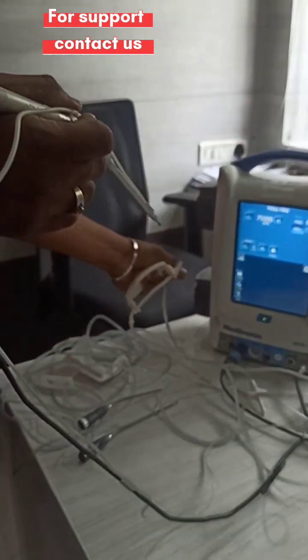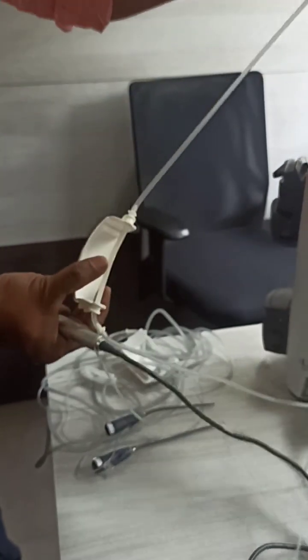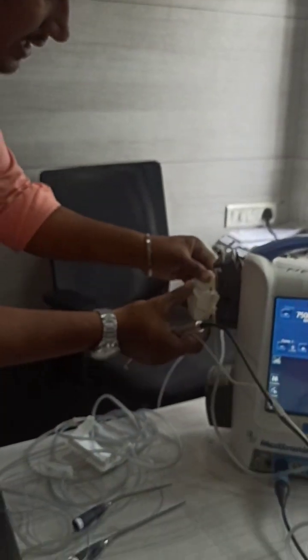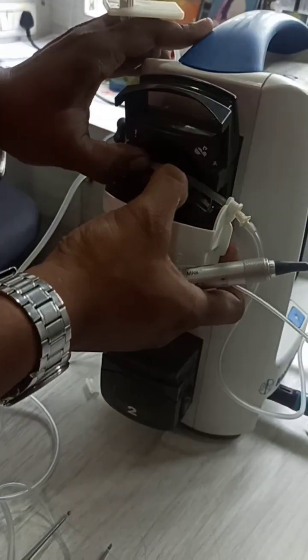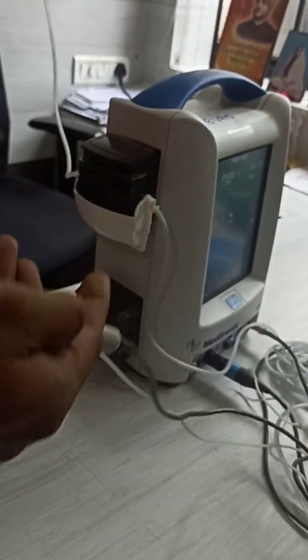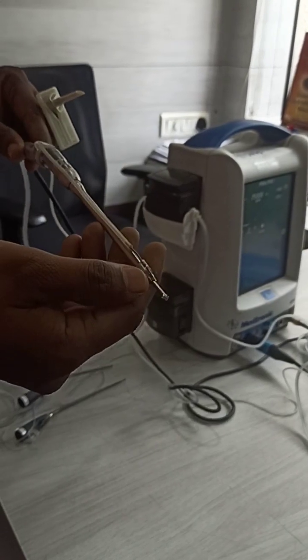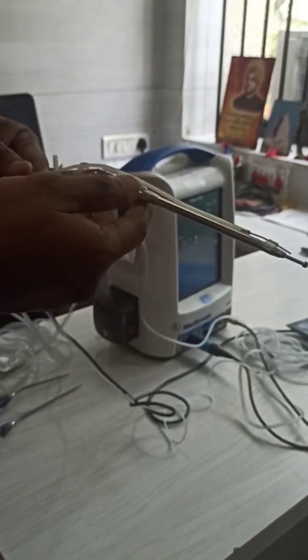Whenever they need irrigation, they connect this irrigation tube. What they have to do is open this pump, then connect this end to the saline water. Connect the tube inside - just press this cap and hold the tube in the center piece, then lock it. Once locked, whenever you press the foot switch, irrigation will automatically come at the tip. Here I am not connected to irrigation, but this is the same procedure they would use.